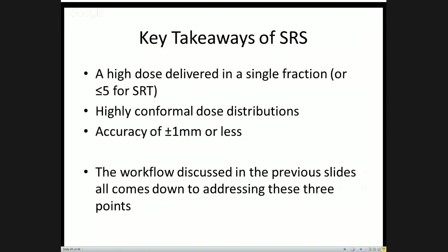As far as if there's 3 arcs, do we cone beam 3 times or 1? Usually we'll only have 1 arc with a couch angle of 0. We may split that up into 2 arcs if I want to rotate the collimator halfway through, so that we avoid irradiating normal tissue for multiple mets. Sometimes that can be tricky on a full arc. But you can't really do a cone beam CT if you have very much of a couch kick at all, because you have to worry about collisions, and that's one of the advantages of using ExacTrac. You can actually check that. But we just base it off of our cone beam that's acquired at a couch angle of 0.